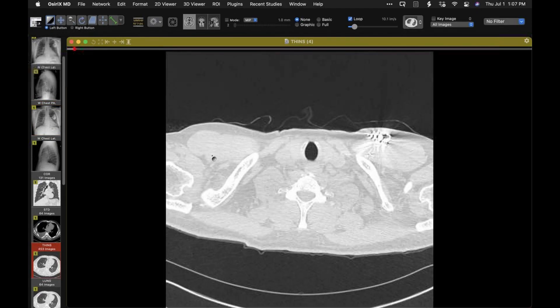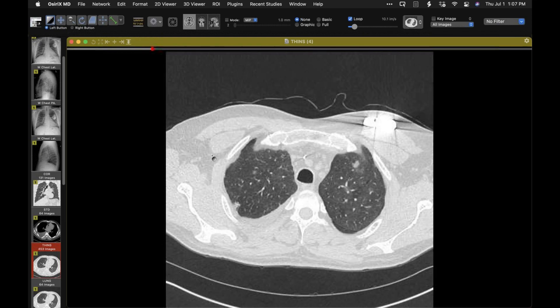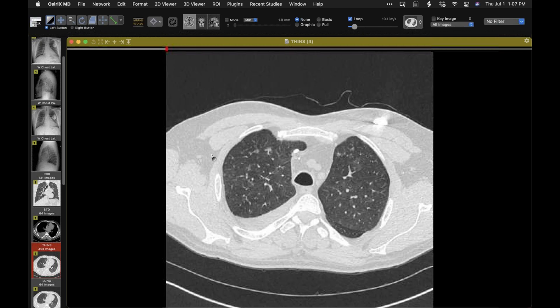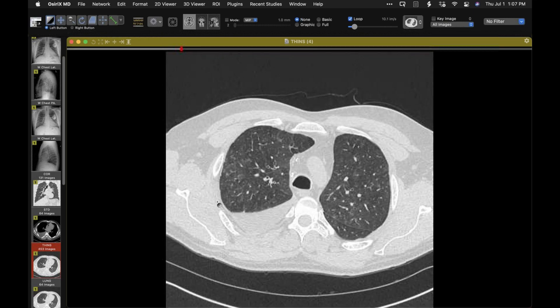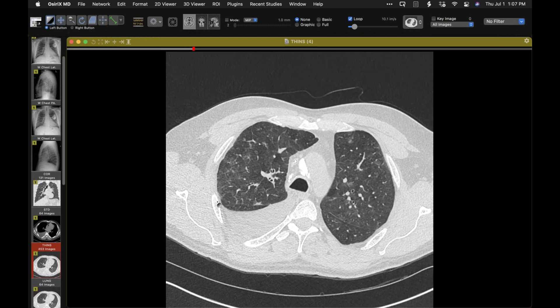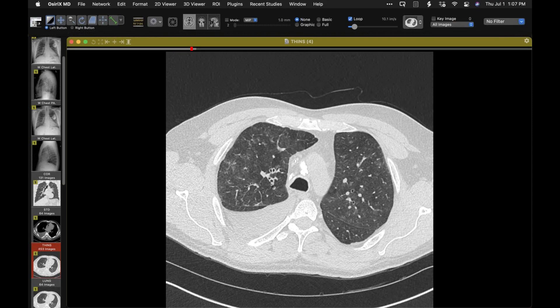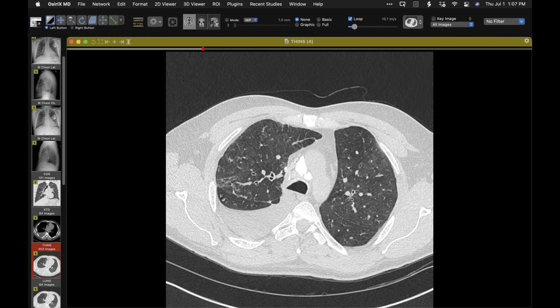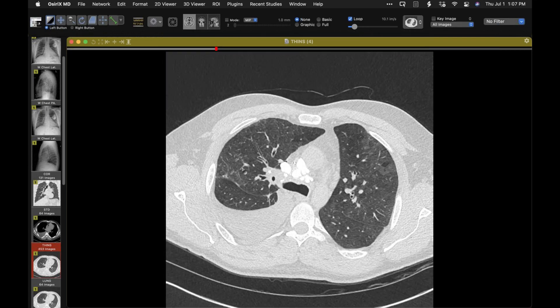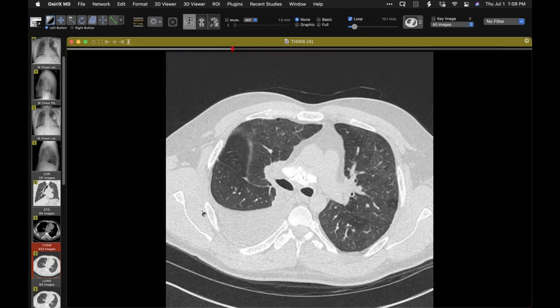Here we are in January 2019, and I hope you can appreciate particularly up here that we have interstitial edema, peribronchial fluid cuffs, some septal lines. Now we have bilateral abnormality but it's asymmetrically severe — there is more lung water. Look at these peribronchial fluid cuffs in the right upper lobe particularly, and subpleural edema compared to the left lung. A nice demonstration of peribronchial fluid cuffs of interstitial edema in relation to those airways and right pleural fluid.